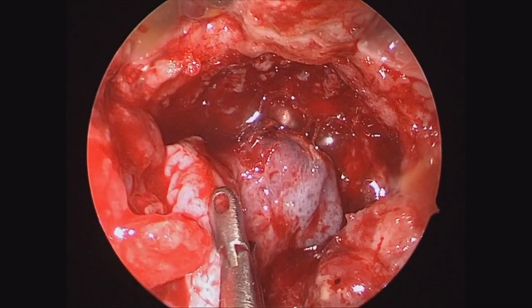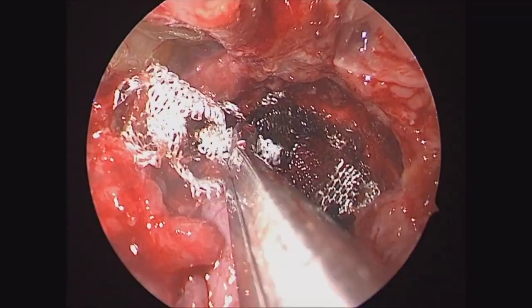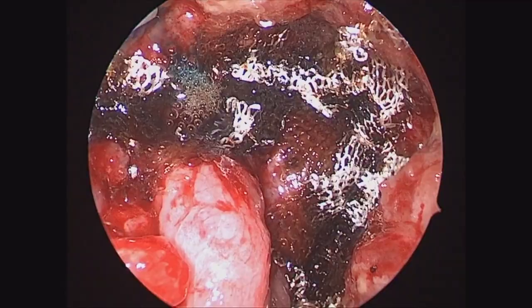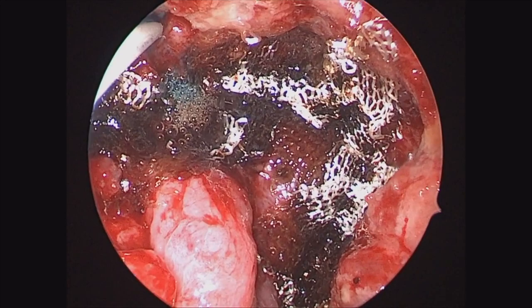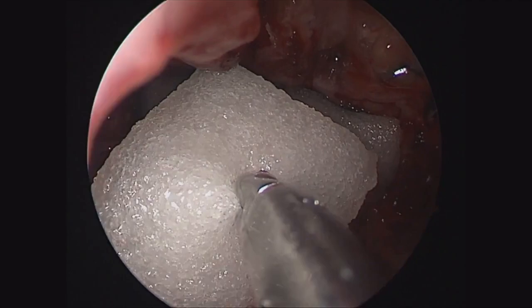Then after that's in place, here we are rotating our right inferior turbinate flap into position. Once again, it has a little bit more of a limited reach compared to a nasal septal flap, but for these dural defects it can work very nicely. We're placing some Surgicel on the edges and a little bit of tissue glue over top on the edges. Then we'll pack that in with some gel foam and nasal pore.